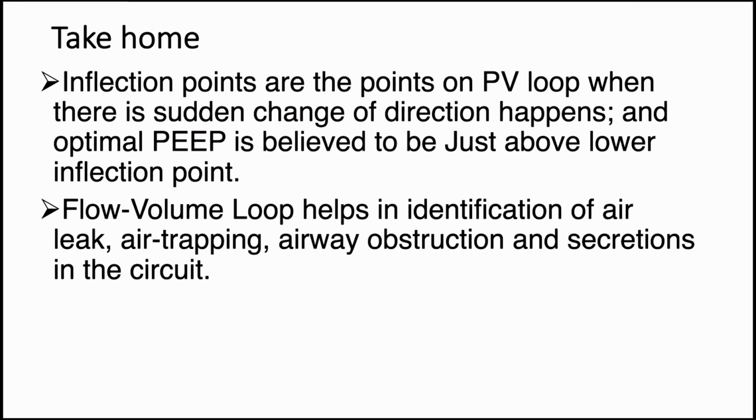I'm just borrowing from an article by Dr. Ram Rajagopalan, maybe around 10-11 years ago. The flow volume loops help in the identification of air leak, air trapping, airway obstruction, and secretion in the circuit.